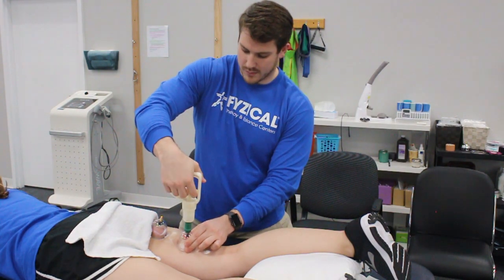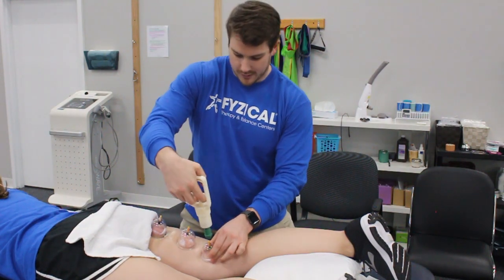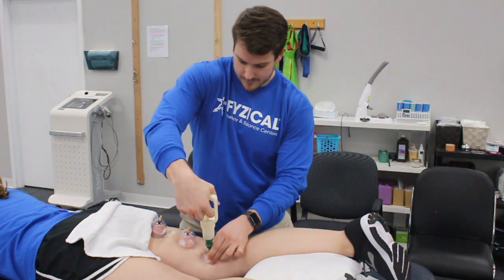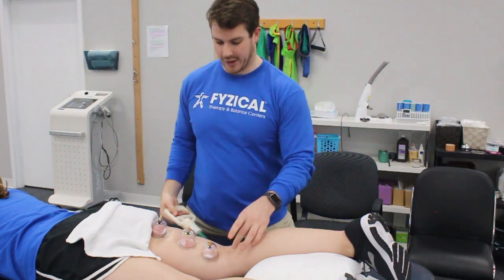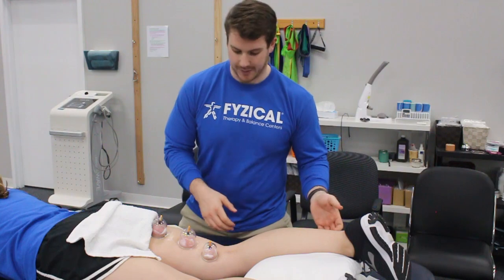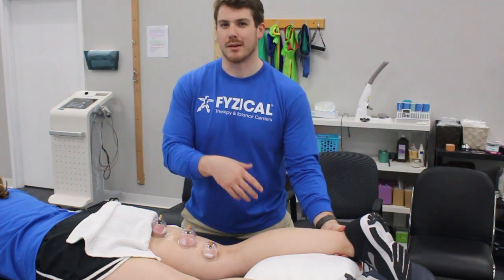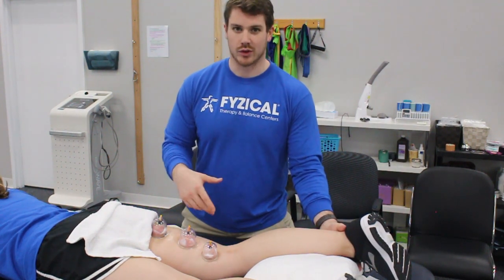We're doing medial hamstring so we're going towards the inside. That looks like a good position — we're going right before the back of the knee. When we're in this position, I usually like to have my patients bend their knees. I'm going to do it passively and I'm going to have Megan here do it actively.